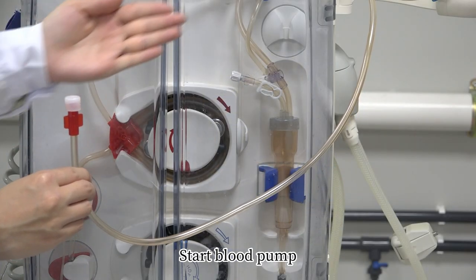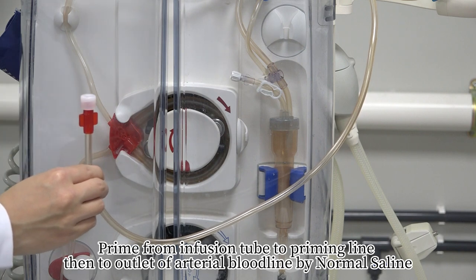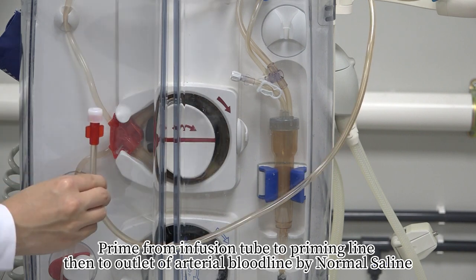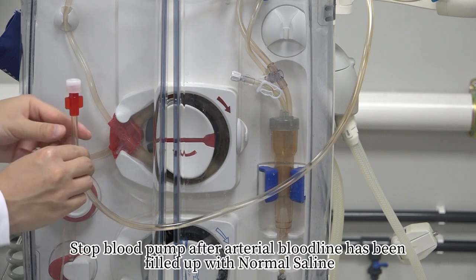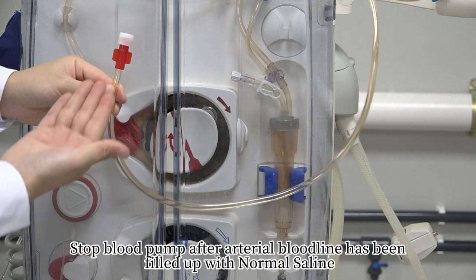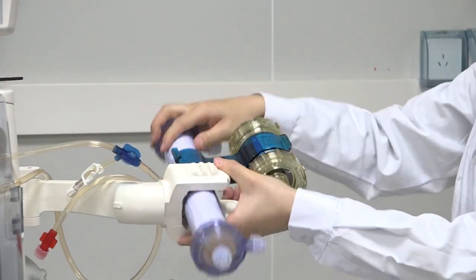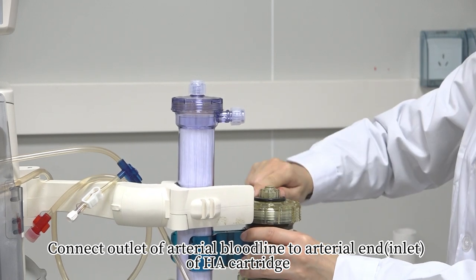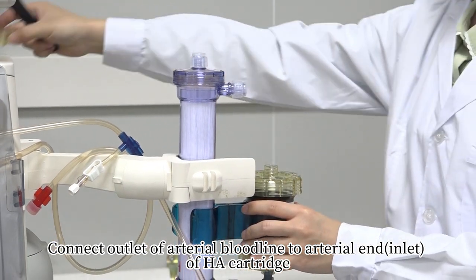Start blood pump. Prime from infusion tube to priming line, then to outlet of arterial bloodline by normal saline. Stop blood pump after arterial bloodline has been filled up with normal saline. Connect outlet of arterial bloodline to arterial end of HA cartridge.